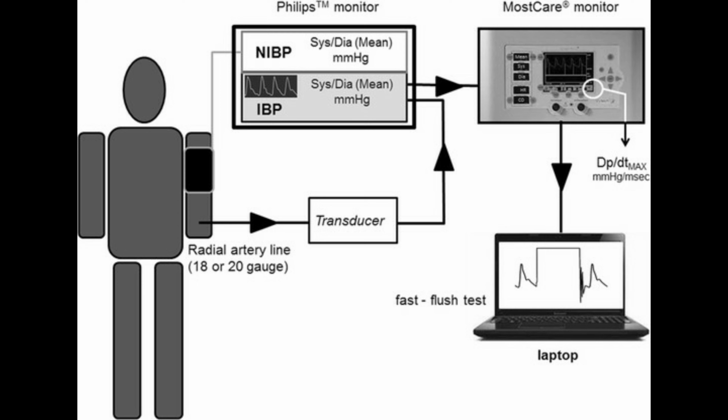In ICUs, you can see two categories of pressure monitoring: invasive and non-invasive. The invasive approach inserts a catheter into an artery of the patient. The catheter may contain a pressure transducer at the tip, or it may be fluid filled and couple the blood pressure through this fluid to an external transducer.